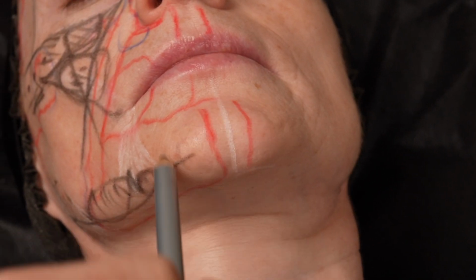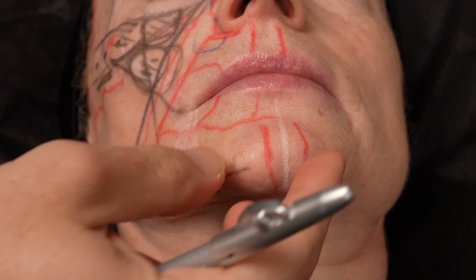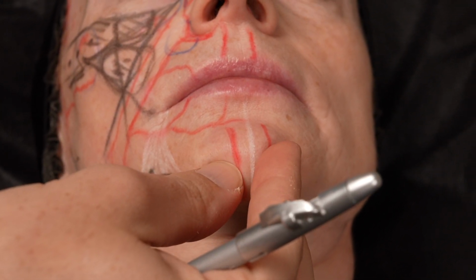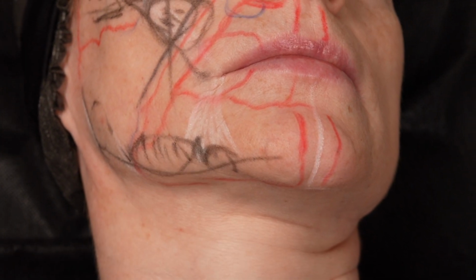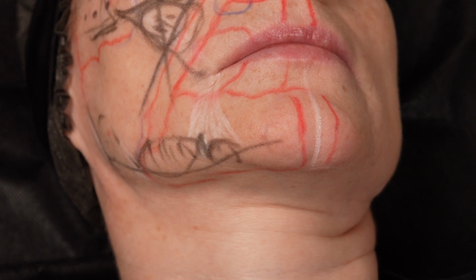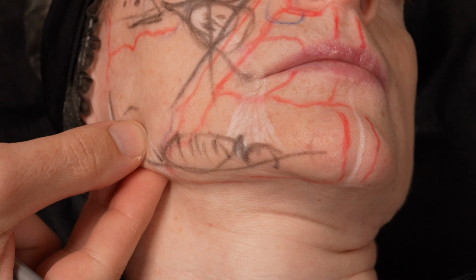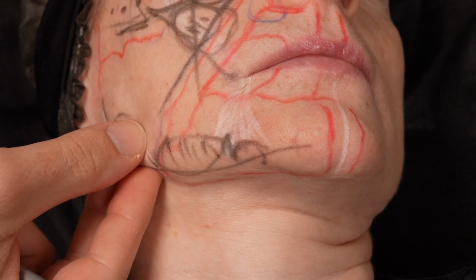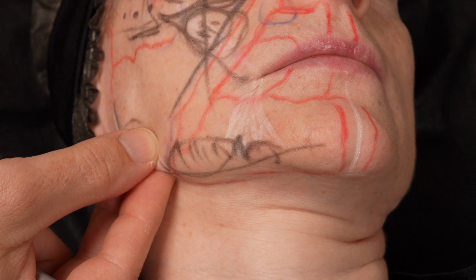Okay, so chin injections, we can work deep fat, superficial fat, whatever. Deep injections, needle, cannula, whatever you want. Prejaw injections, deep needle, deep cannula, superficial cannula, whatever you want. Double layer you can inject. Corner of the mandible, you can inject deep, superficial, cannula, needle, doesn't matter.